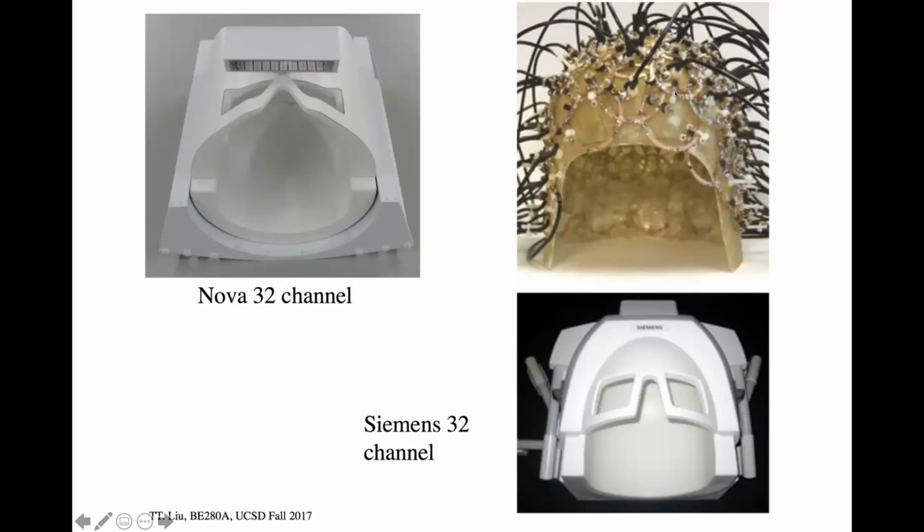This coil really only cares what's going on in the front. And so if you have enough receivers, say this has 32 receiver channels on it, you can make 32 separate images, each one of the sensitivity of each little coil, and add those up. And that gives you a better sensitivity, right? Better signal to noise, because the coils are more local to the signal that they're receiving.